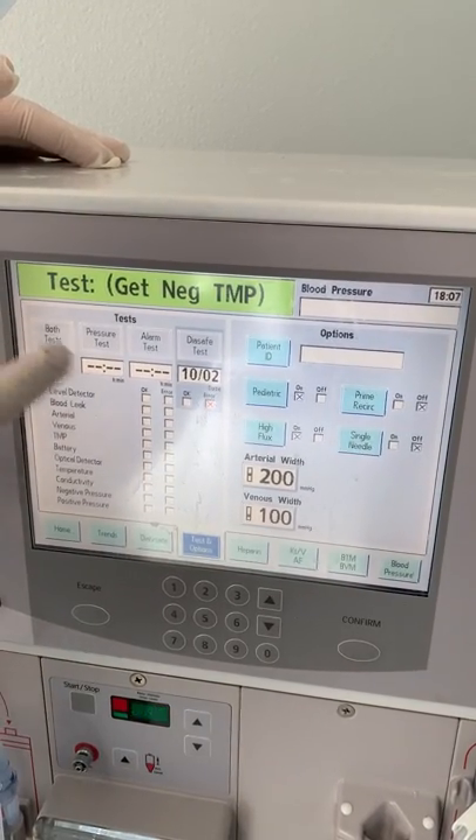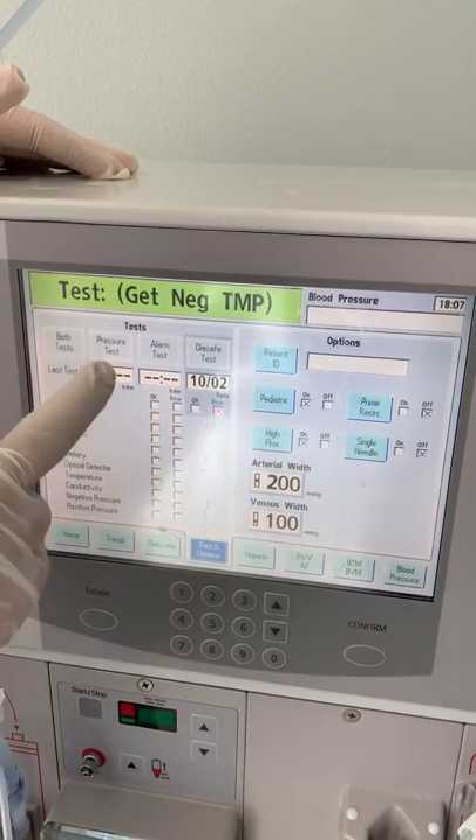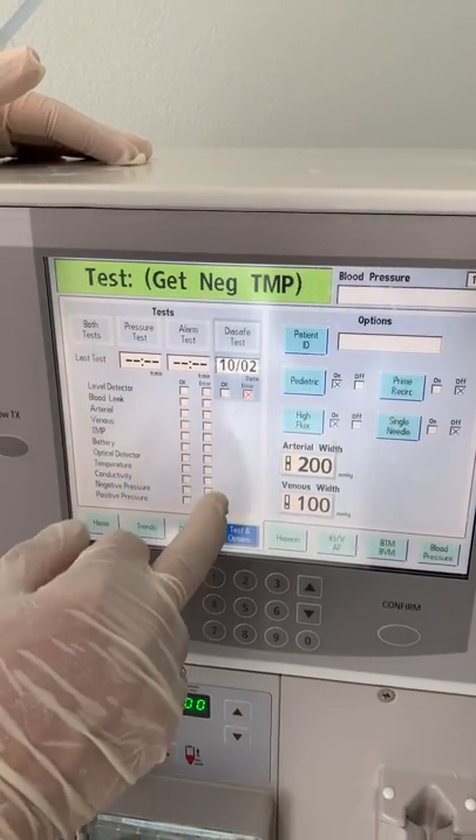All the tests listed here need to be completed. If any one of them fails, you will need to retest it.